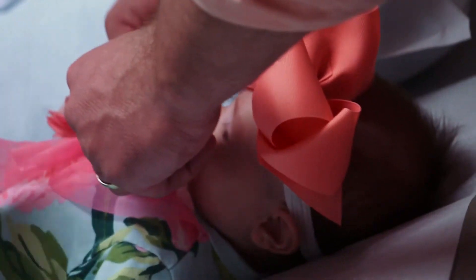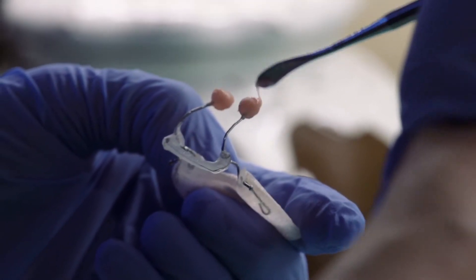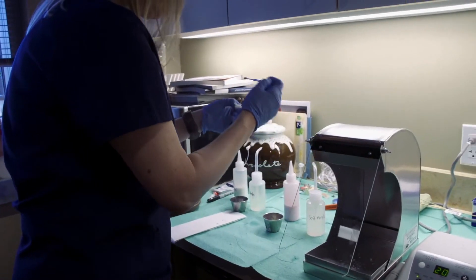The NAMM adjustment is when the baby comes in for their appointment, we take the appliance out and I take it into the lab and I'll add what's called soft acrylic to the tips of the nasal stents, which form the nose, and I'll also add soft acrylic to a portion of the appliance where we're trying to close the gum segments and get them as close together as possible.